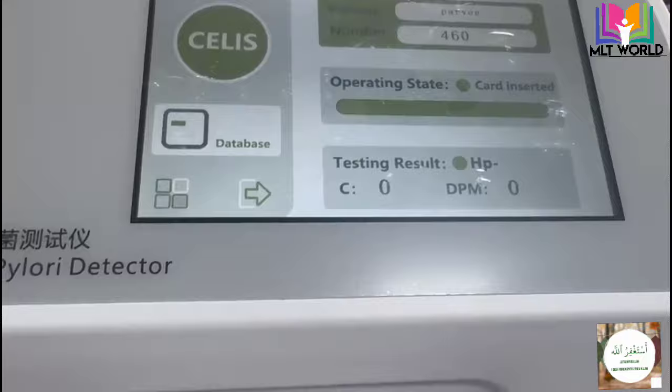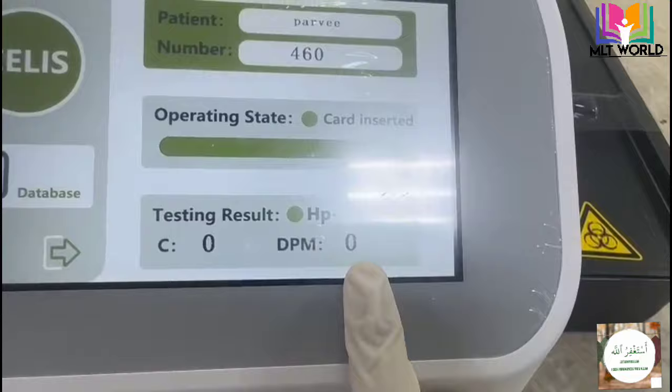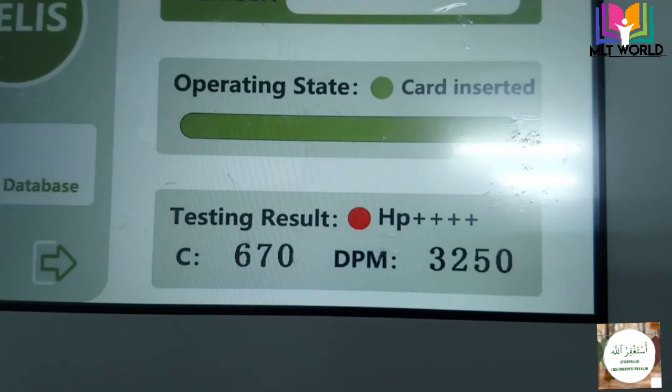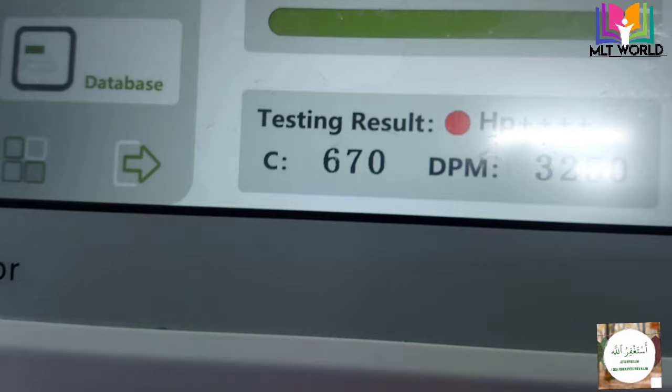Now you can see the result is negative — HP negative — and when the result is finished it blinks a red light. This means the patient has no H. pylori infection. I will also show you a positive result: here it is highly positive, showing HP 4-plus at 3,250. Remember, you must remove the stickers before inserting the card into the machine.